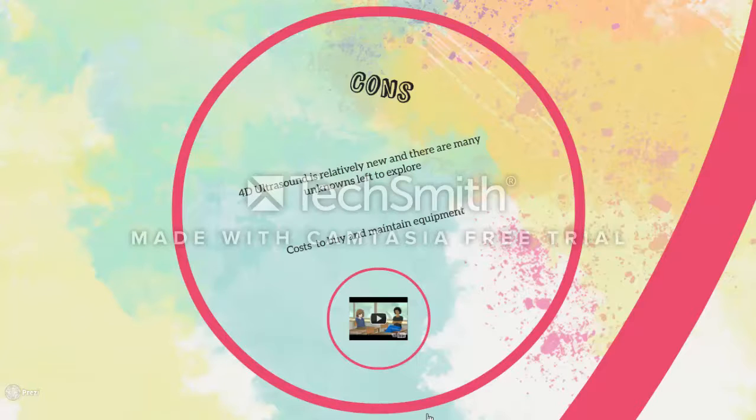Another of these cons for ultrasound would be costs, and this simply put is generally attributed to the cost to buy and build equipment to run ultrasound, and also the cost towards the taxpayer depending on their health insurance cover.